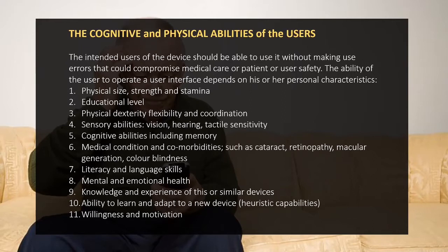The knowledge and experience of this or similar devices. So again, that's a cultural understanding. You've got to be very careful not to change the way things should operate. So don't have things turning counterclockwise where existing other devices turn clockwise, for instance, as a simple example. The ability to learn and adapt. And the following point, the willingness and motivation is incredibly important. You've got to have someone who really wants to interact with the device. If they are approaching it negatively, it can throw everything off the rails.